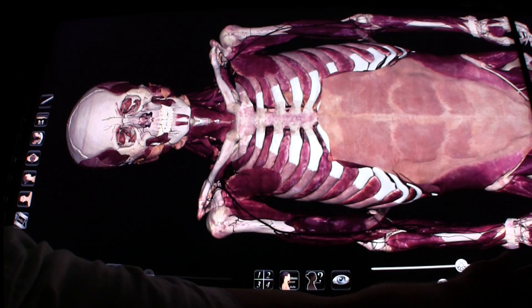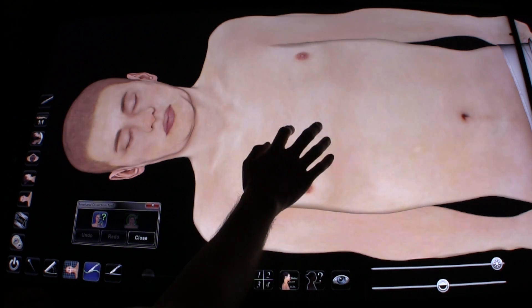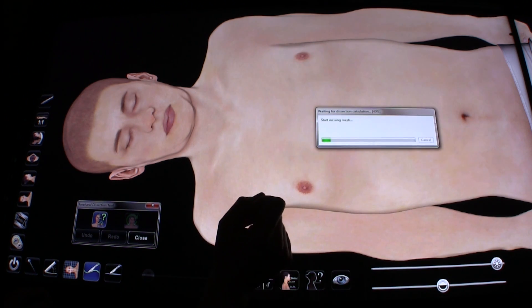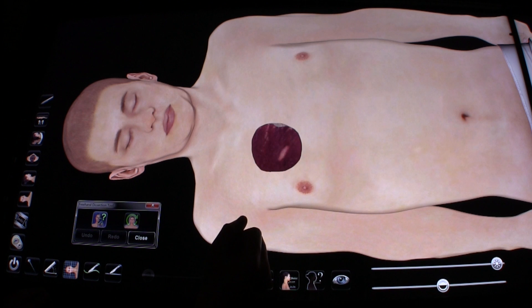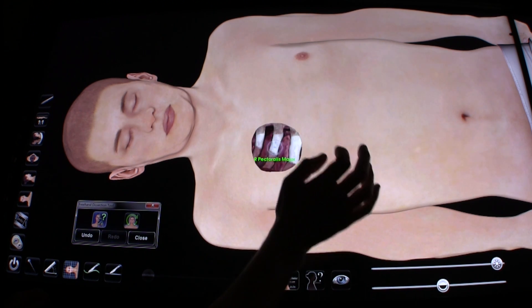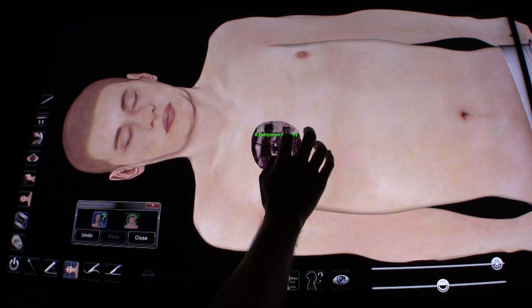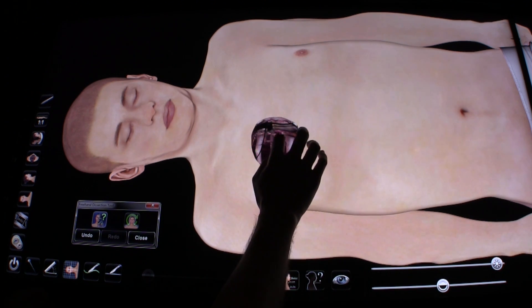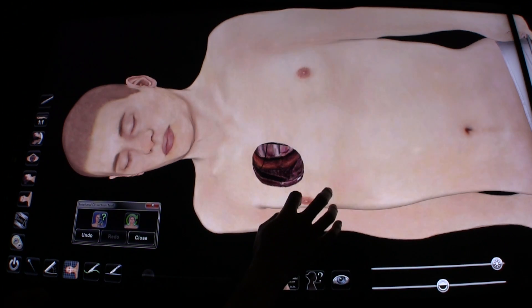For the next tool, I'm going to bring the model back all the way to the skin layer. We have the freehand dissection tool — that is the green line with the scalpel. When I select that, it brings up a window. What this allows you to do is draw any freehand shape on the table, tap inside of it, and it will remove the top layer of skin from just that portion of the model. As I tap, it starts to remove more and more layers from within just that part of the model, and you'll notice it even brings up text telling you exactly what it is that you have removed. Because this is fully three-dimensional, you can rotate it to see a lot more inside as you move it around.